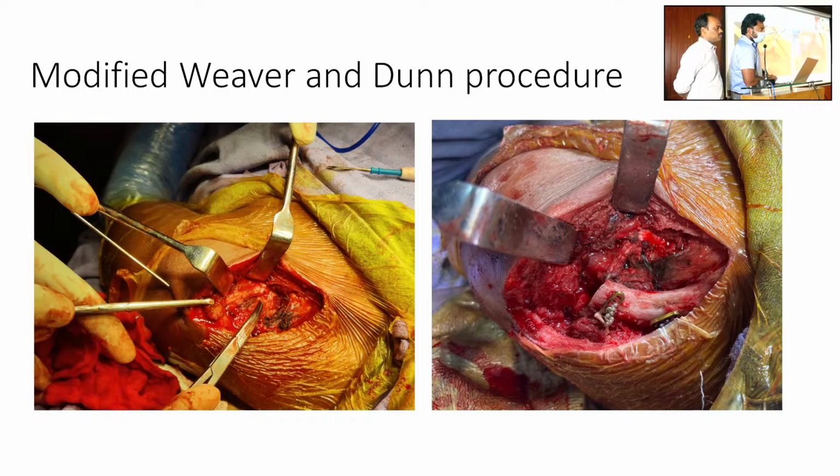You should have put a diagrammatic representation of the hook. Otherwise, by looking at this, you will not have any idea about it. So did you cut the lateral end of the clavicle? Yes, sir. Up to the lateral 2 centimeters is excised.